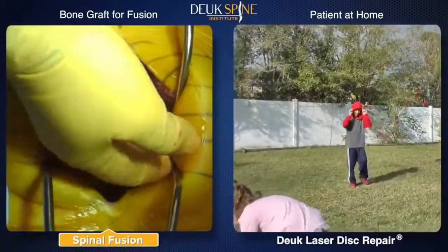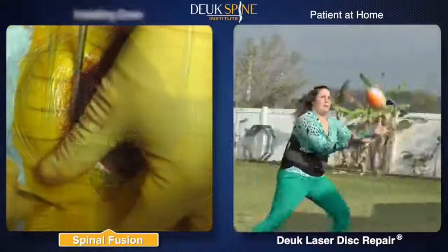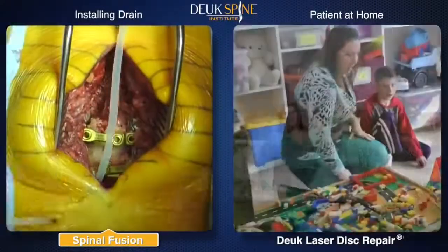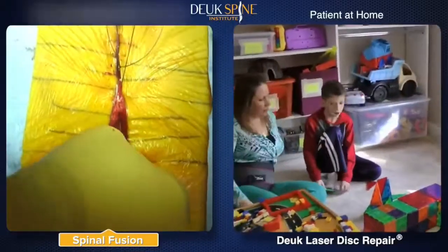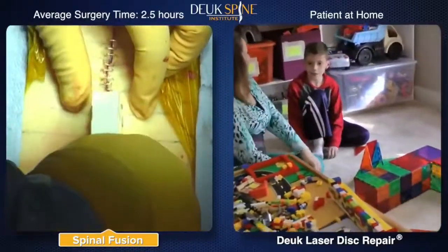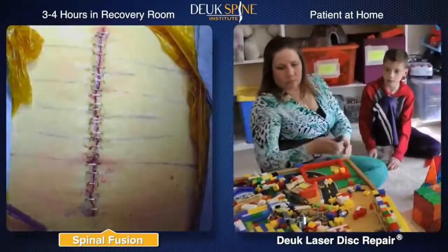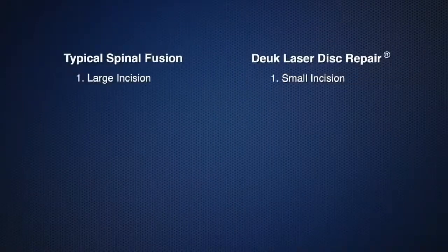These morselized pieces of bone will eventually grow together to help promote the fusion process. Prior to closing the wound, a temporary drain is installed to allow excess fluid to drain. Average surgery time of a traditional 2-level fusion is 2.5 hours, with an additional 3 to 4 hours in the recovery room. As we've seen, in comparison, a spinal fusion requires a much larger incision and results in a significant amount of scar tissue.